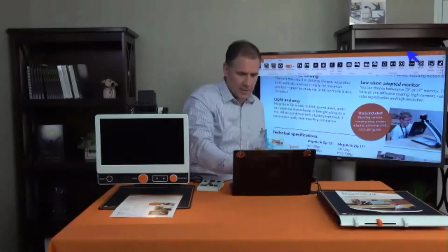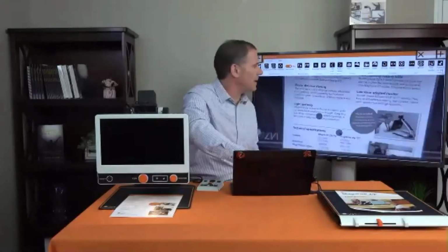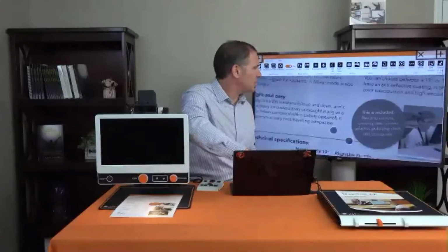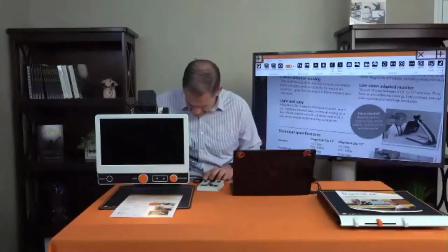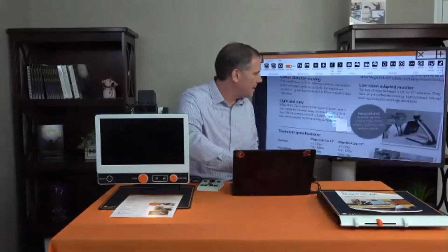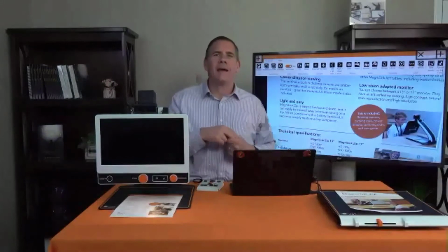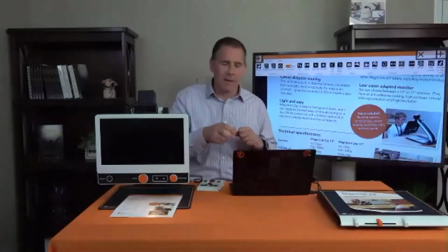But I could touch here, and I can pinch. I'm pinching right now on the screen, and I'm zooming. And I tapped it. Oh, tell me about that. It does. Wow. So with 2 fingers, I can tap and change it to grayscale.